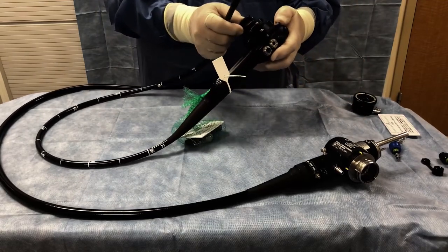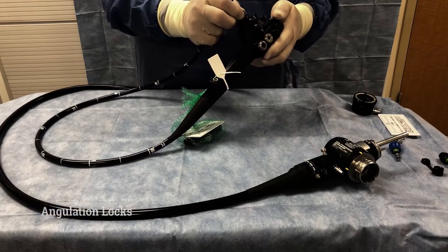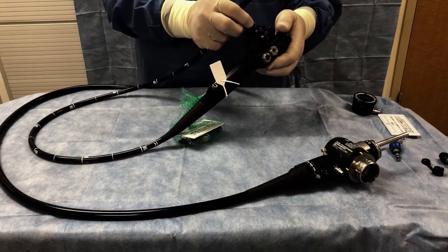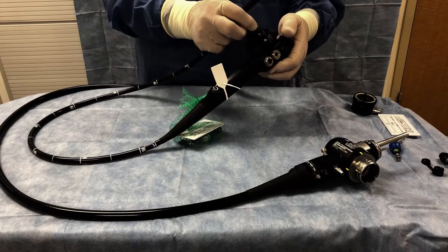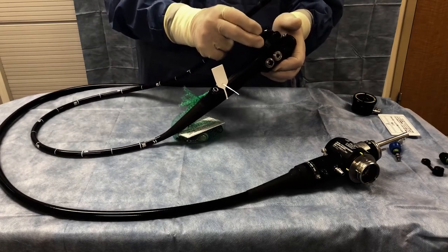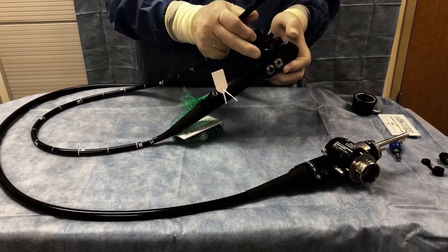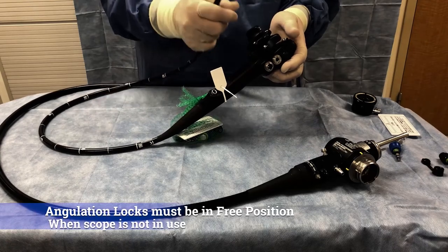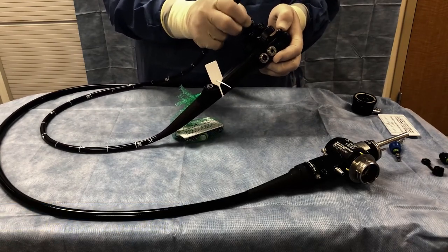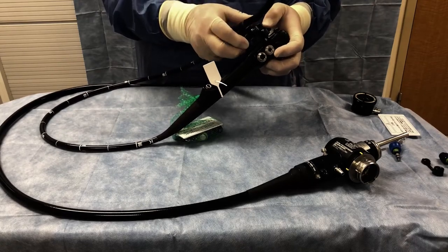Also, with these control knobs, there is a locking or brake with each one. When we store these, they should always be in the free position. But if the doctor is trying to hold an angle inside the patient, he will push these brakes and it will keep it in the same position. When we process the scope afterwards, we always make sure they are back in the free position.